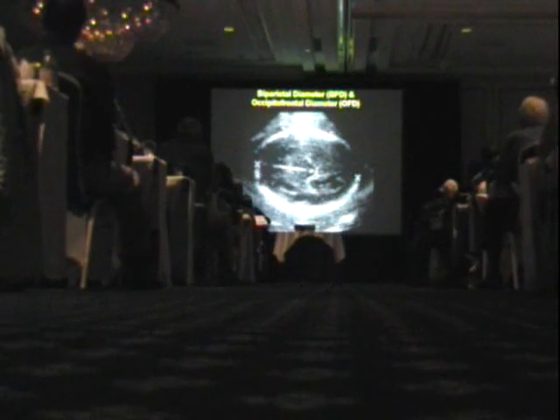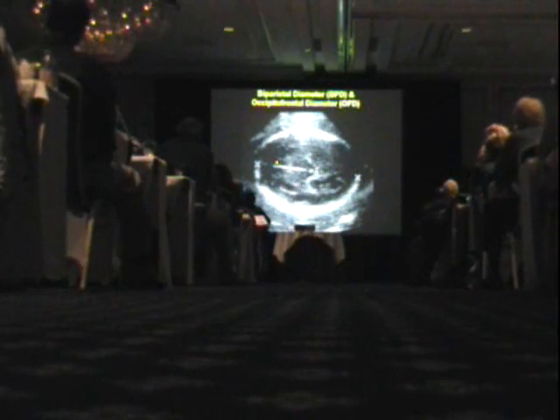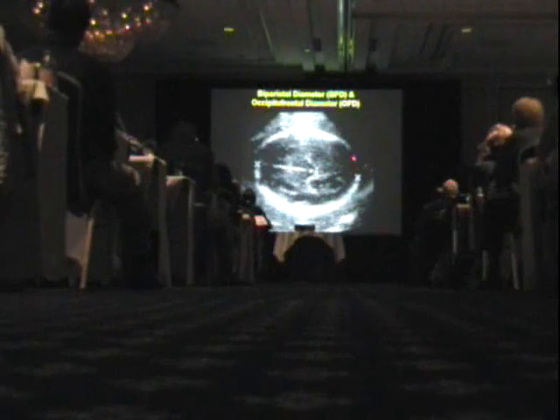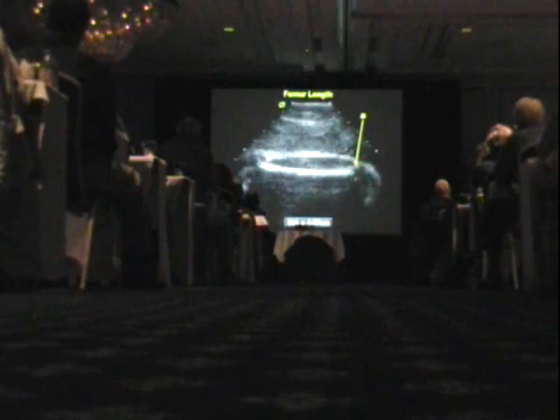As in this case, this is a nice biparietal diameter with a midline symmetric. The midline echoes are nice and symmetric, hypoechoic thalami. Even though I don't see the cavum septum pellucidum, I'm confident it looks like the right plane. We haven't cut back into the posterior fossa here. You turn to maximize the length, and you get a good BPD and OFD or head circumference.